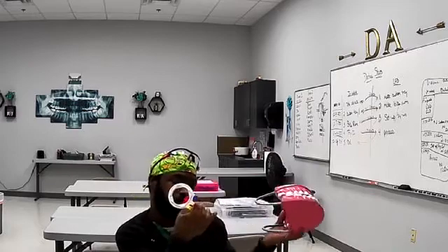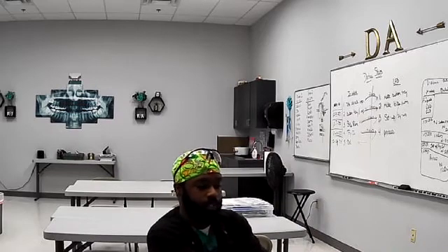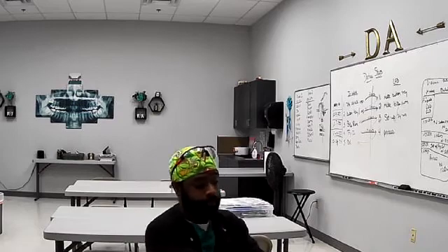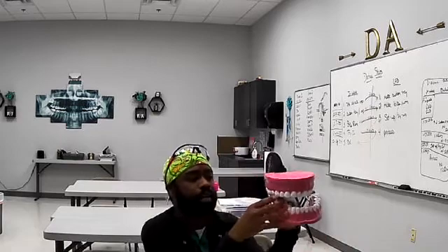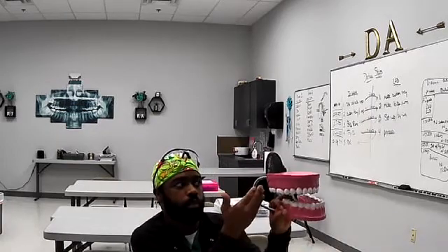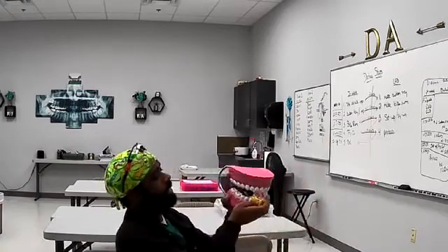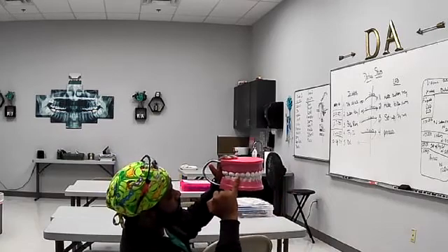Your last 2 to 3 teeth, depending on if they have wisdom teeth, will already be done. Let's say they don't have their wisdom teeth, so they only have teeth 2 and 3. Tooth 1 is gone. So the bitewing got these 3.